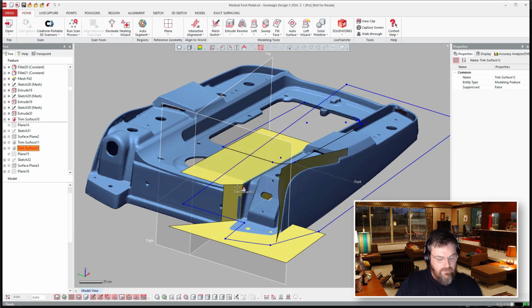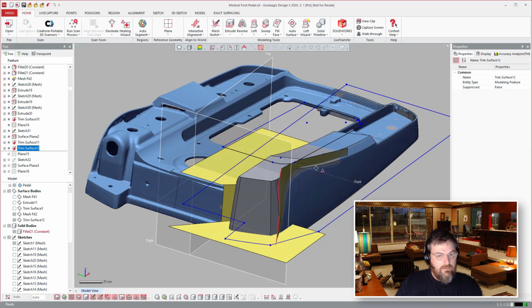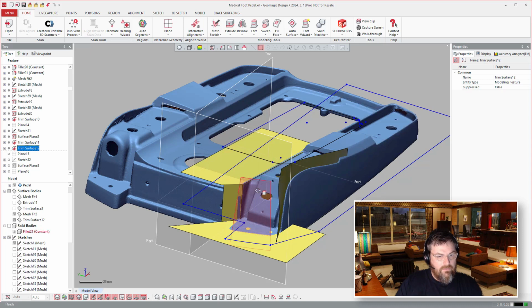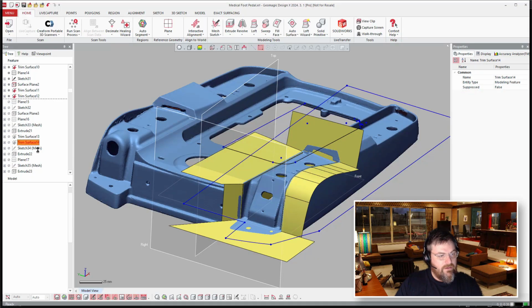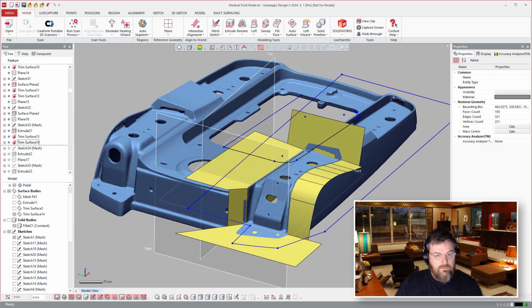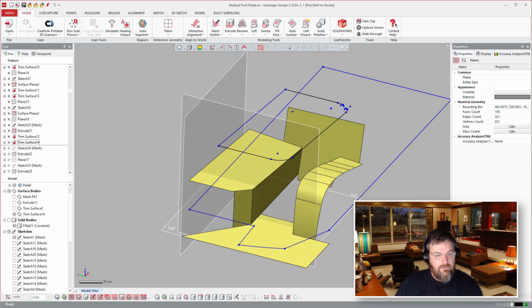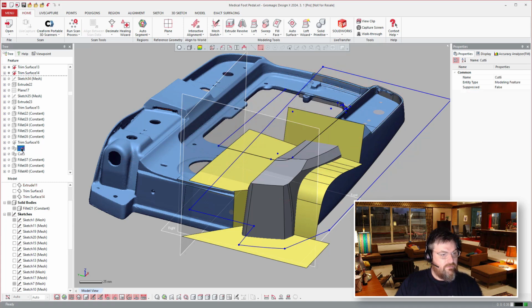And then I'll turn the solid on here in a second, just to refresh where the solid's at versus where the mesh is, so you can see the approach here. So if I turn that solid, you see here, it looks like we're gonna cut this all away here in one stage. So now we'll just come forward a few more fits and extruded surfaces and a few more trims. And then you'll see that master tool here in a second, because then we'll do a cut after the end of these stages. So I'll hide the mesh. There's where we're at so far. And here's where the solid is. So let's go down to the cut.